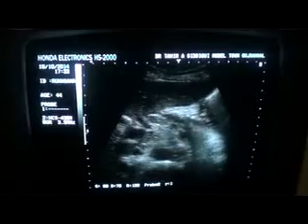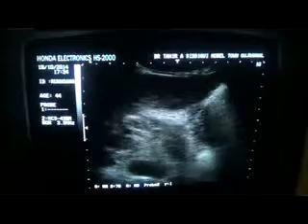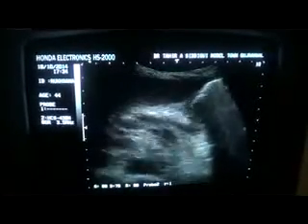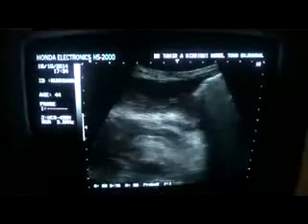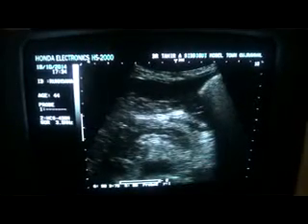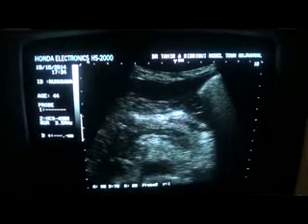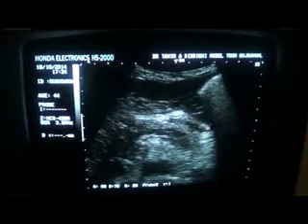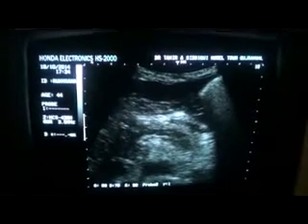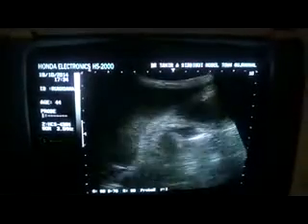She has been operated upon, but as I don't have any lab profile or any operative surgical notes, I have to rely on all what I am seeing now. What I am seeing is that the pancreas is normal. This is the pancreatic band, white band of tissue is the pancreas, and all the rest is the bowel. This is the bowel, and this is the splenic vein that you are seeing as a landmark for the pancreas. This is the aorta, and this is the superior mesenteric artery in transverse section.